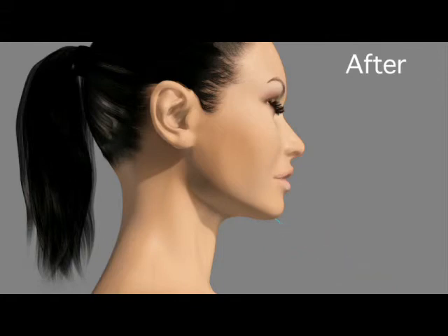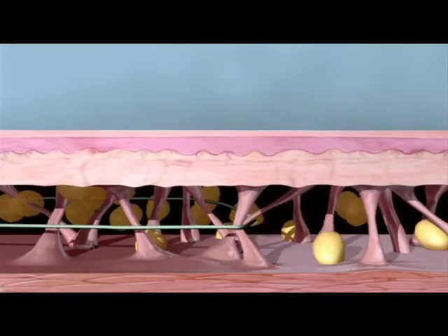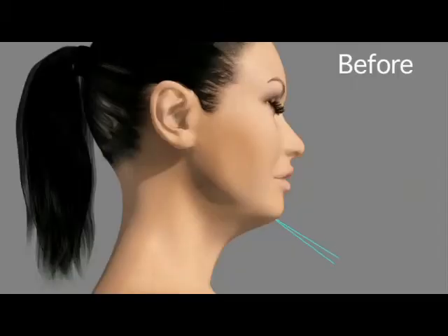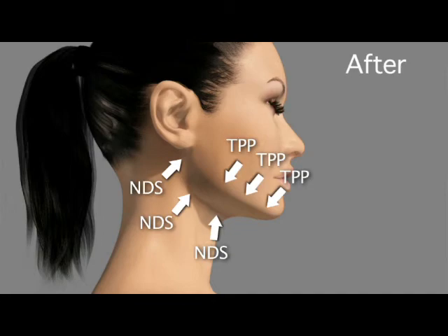During the first month, when the patients open their mouth widely, they will note some dimpling, which resolves in 4 to 6 weeks. This illustrates what happens when the suture matrix is tightened: the skin approximates the muscles, thus closing the dead space. Patients are placed in chin straps as well as cotton compressive dressings overnight. They are instructed on the first day post-op to take a shower and apply ice as often as possible.